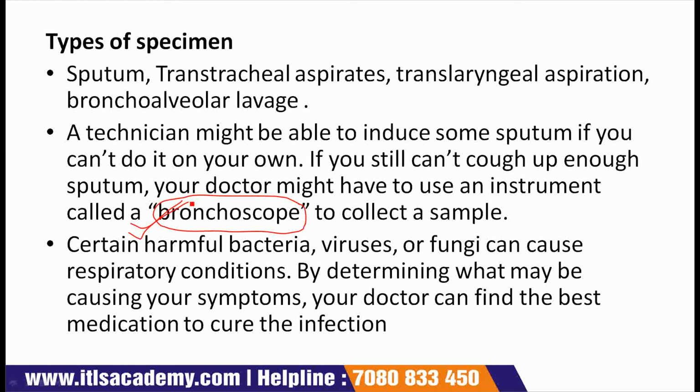The bronchoscope has a light and tiny camera. Your doctor gently inserts it down your windpipe to locate a sample. You will be given drugs to relax you while this happens, but you may be hoarse and have a sore throat afterward.